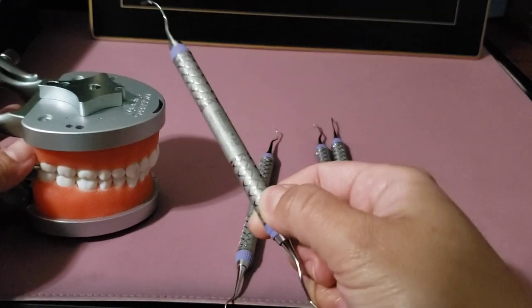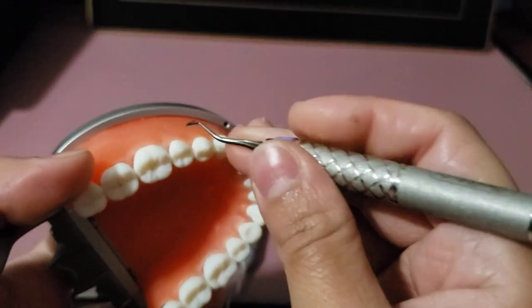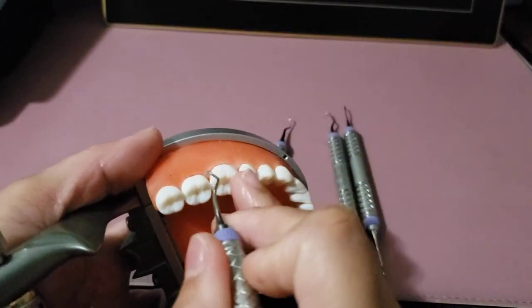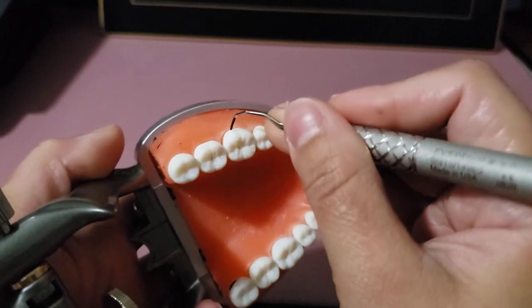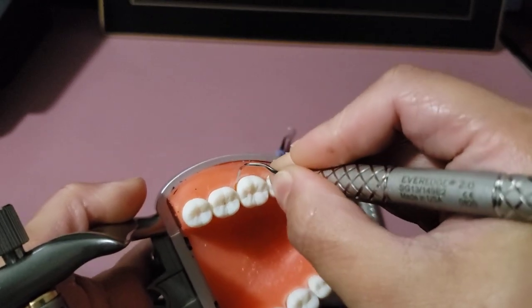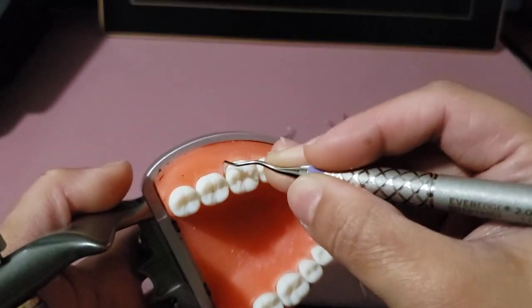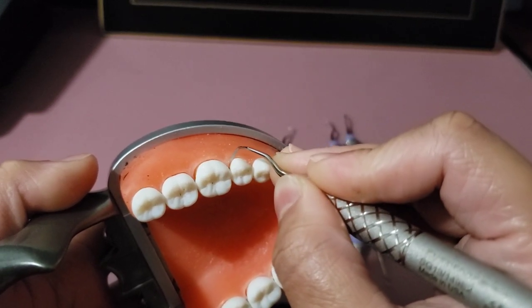For Gracey instruments, I'll demonstrate on the mandibular left side using the 13-14 since we always start at the distal. Confirm the correct working end — verify which side is correct. At the distal line angle, close, insert, open away such that the instrument is parallel to the long axis of the tooth at all times, then rock until fully in the proximal. With this instrument, do not go back mesially.